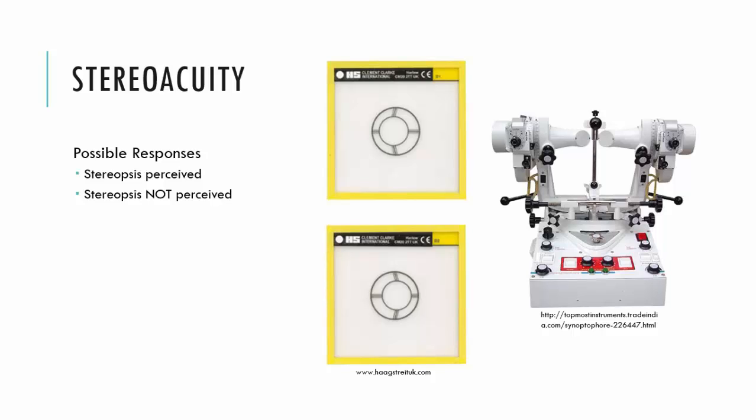And just a reminder that with the Synoptophore, we're not actually measuring the stereoacuity level. We're not recording the minimum disparity the patient can perceive. We're simply indicating, do they have stereopsis or don't they have stereopsis?